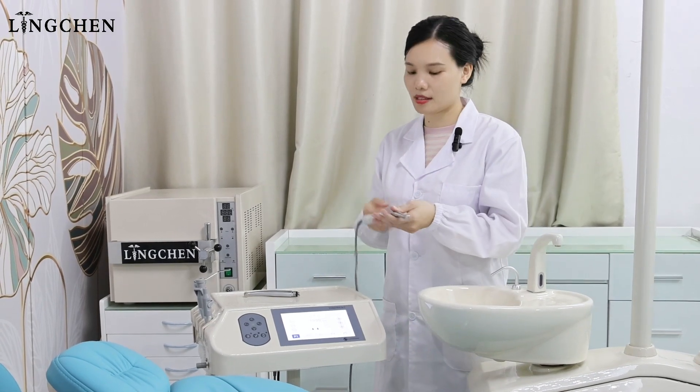After the dentist finishes the work, just remove these cables and put them into sterilization. And the assistant tray can be used as plan B.